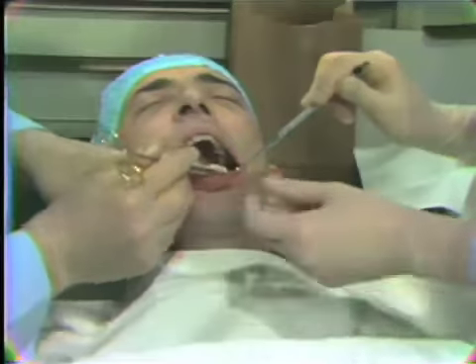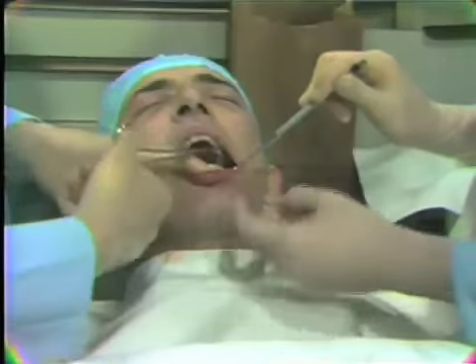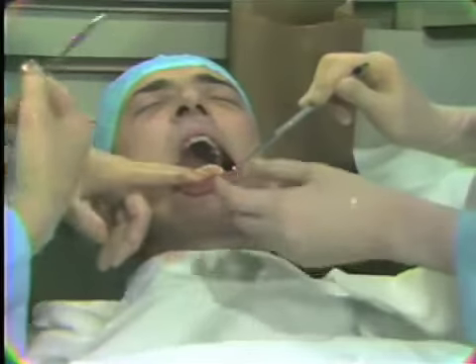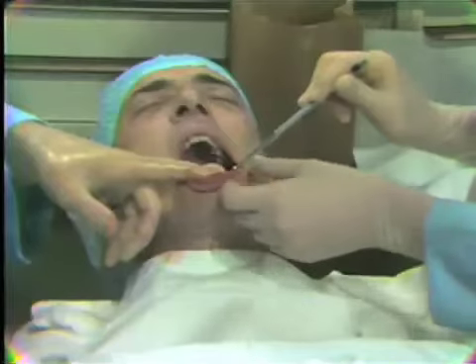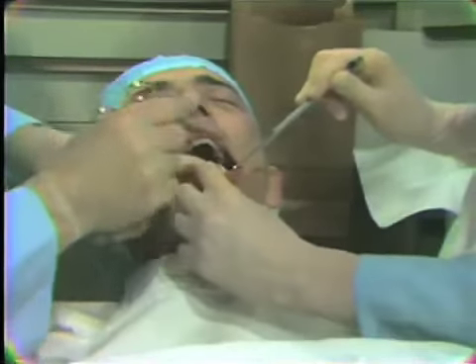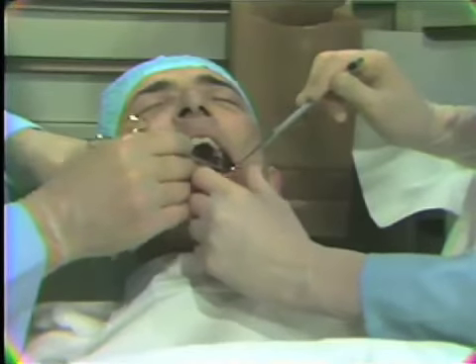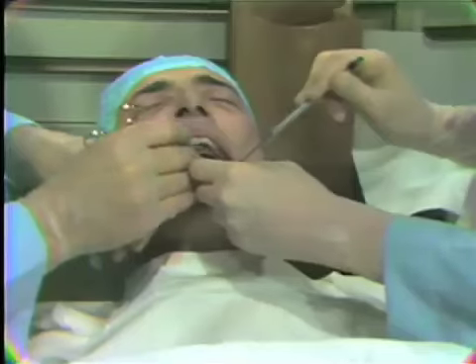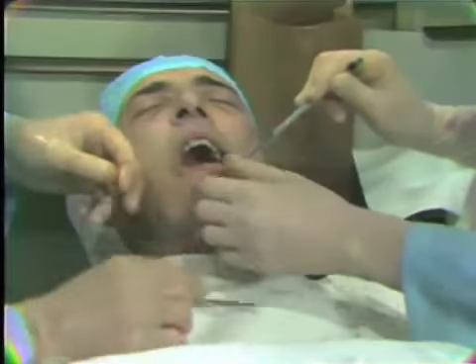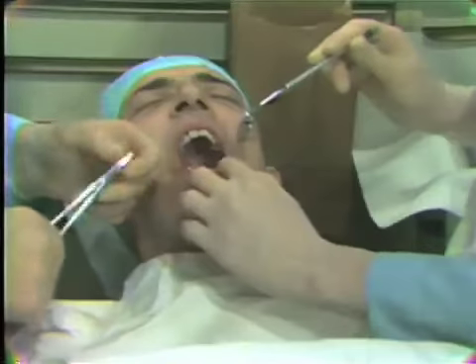The interproximal area between these teeth, as you may have noted, the teeth are malposed and are close together, some difficulty in passing the suture through the interproximal area. You note, though, that the assistant has guided the suture so that we are able to get into the interproximal area, and so that the suture then does not drag across the chin of the patient. That area being quite tight, we'll have to pass the suture through the contact point before we can gain access to the lingual.